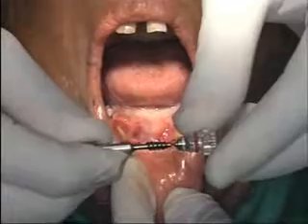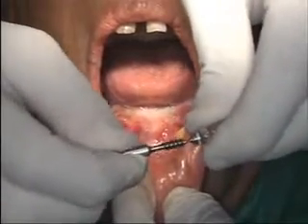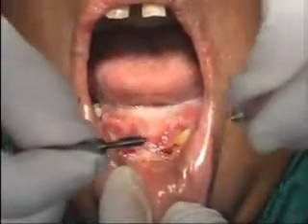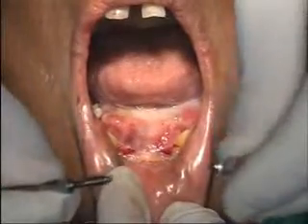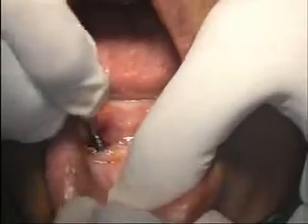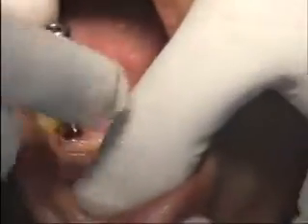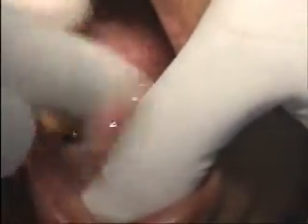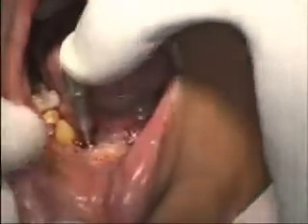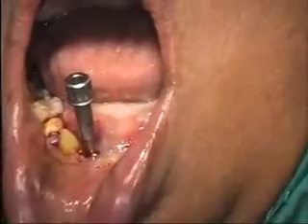Then I have to break here. Somebody was asking me in the past — yes, you saw that now. Take this BCS implant here. First few turns will go with the hand. Now I cannot turn it with my hand, so I will now take the ratchet which has got out and in. In should be towards me.